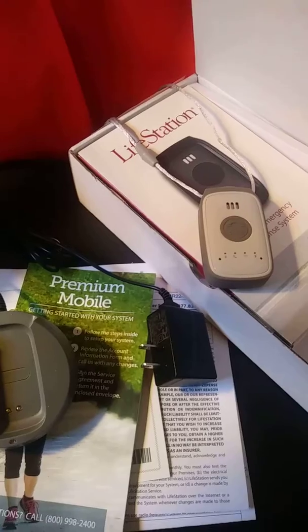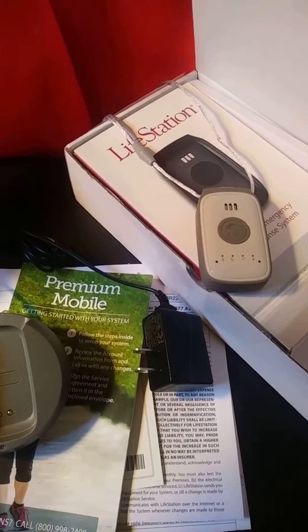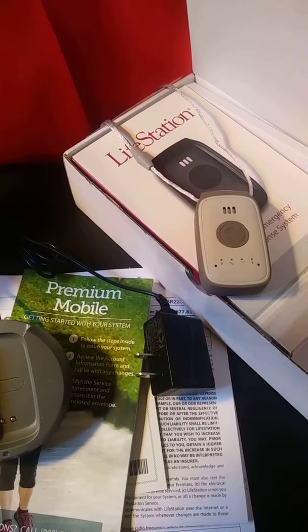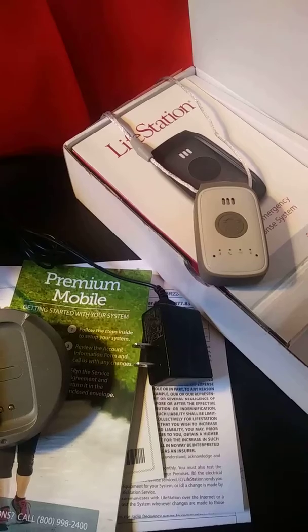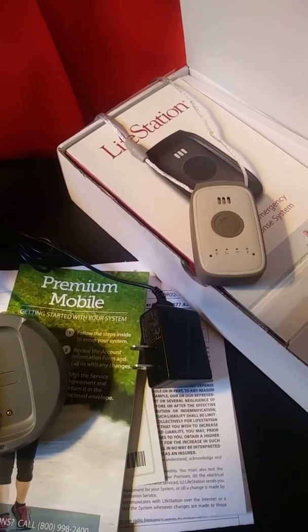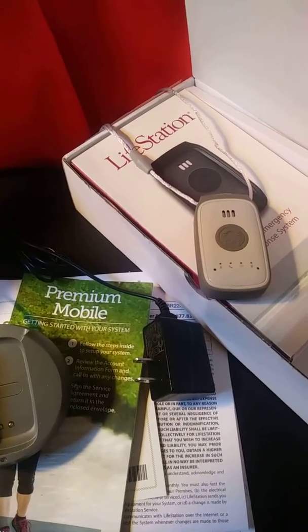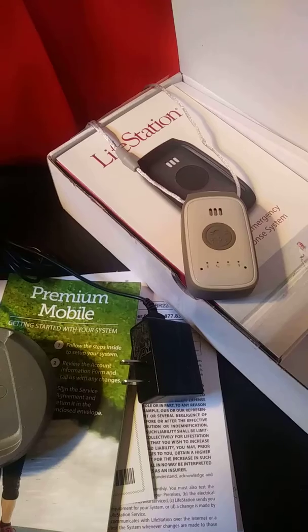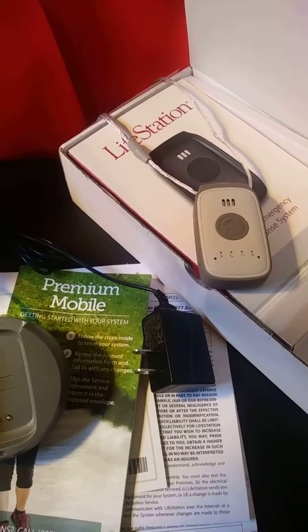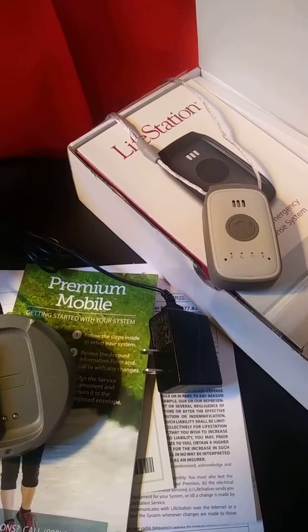I have a service dog. She was with me through this last major seizure and got me through the seizure, but I have not yet trained her to push a button. And I don't know that you want to train your dog to push this particular button, because even though they say if you hit it accidentally, it's not a problem, it's better if you just make sure you can push the button. If you push the button, they will call you on the unit right away, and if they can't understand you, depending on what you set up with your contact information, you can work out a plan of what they're going to do and go from there.